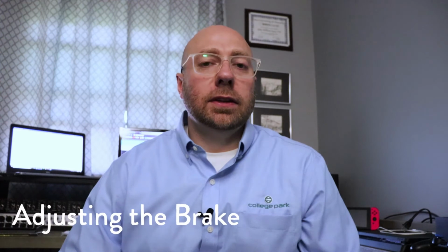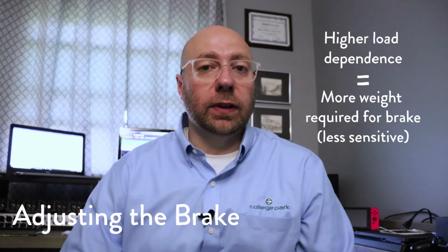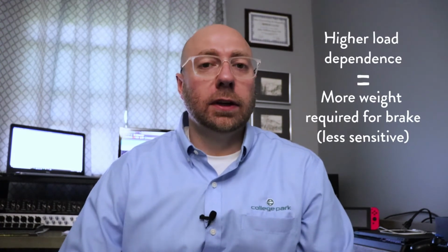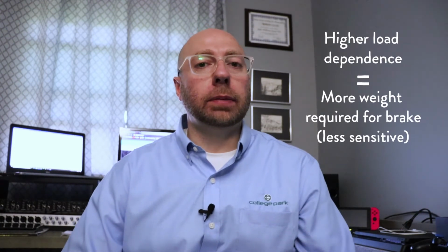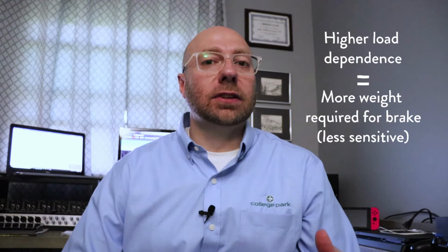Load dependence is the brake sensitivity. So the higher the load dependence, the more weight is required to activate the brake. So a higher load dependence means a less sensitive brake. A lower load dependence means a more sensitive brake. It takes less weight to activate the braking function. Now, out of the box, it's set to the most sensitive function. So the load dependence is at its minimum.